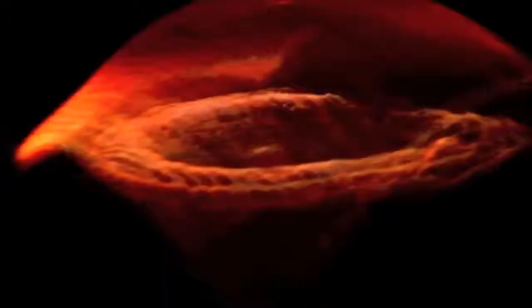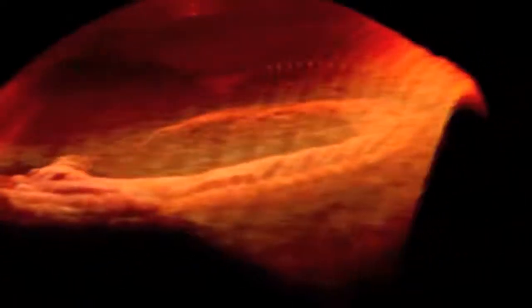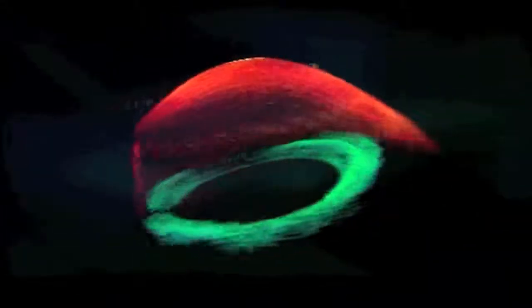In this study, we present dedicated tools for analysis of corneal topography in patients with keratoconus pre- and post-implantation of intrastromal ring segments. The high amounts of distortion present in these diseased corneas are particularly challenging, and even more so the presence of intrastromal implants with a different index of refraction to that of the cornea.